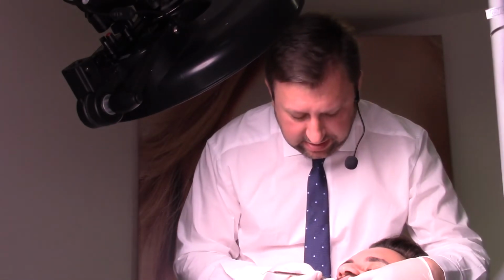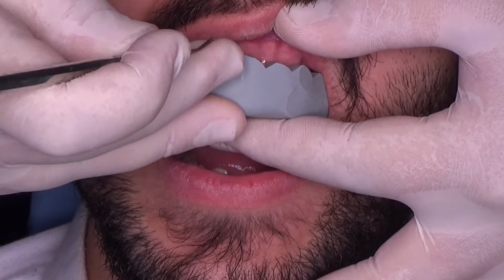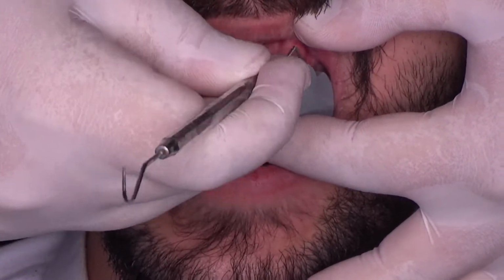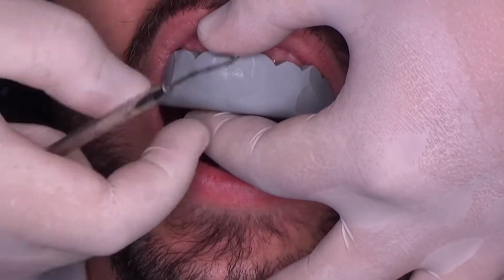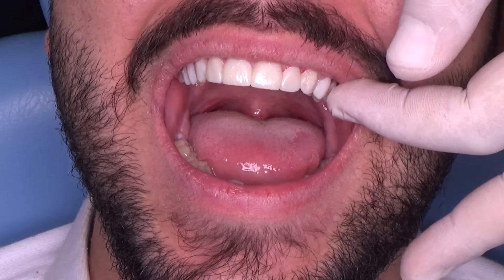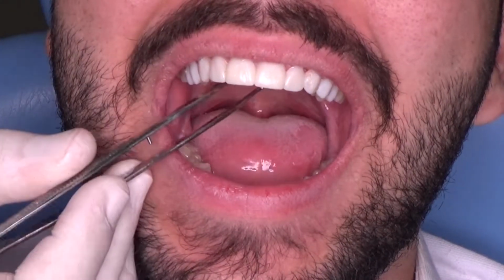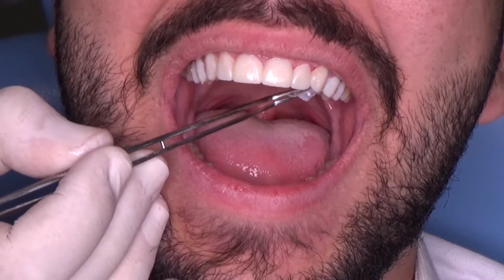Okay. Yes. So before removing this, you have to slightly open the silicone. You see what I'm doing? Otherwise, everything will fall out. And now the big moment. I hope everything will fit. Oh, I'm happy. I hope you're happy too. And I have a happy patient, so everything is fine. I will remove the palatal axis, you see, very gently. Otherwise you can break all the aesthetics.